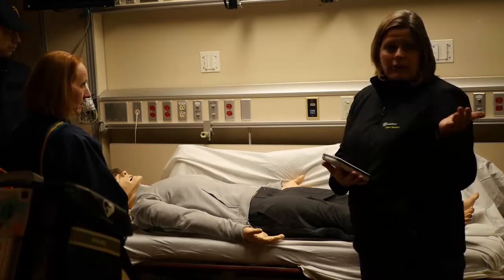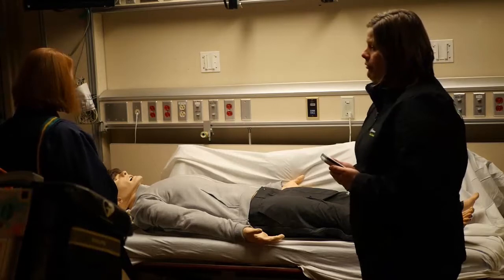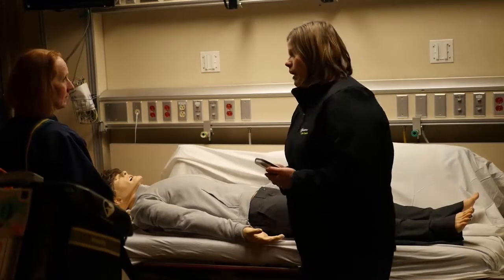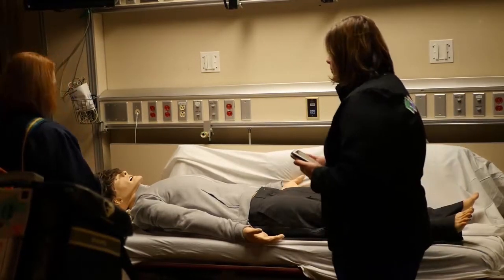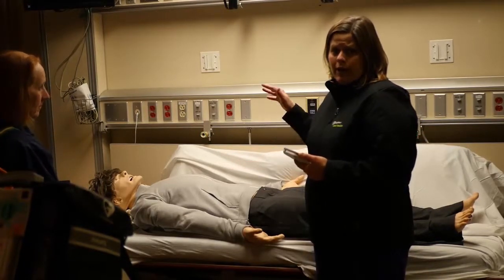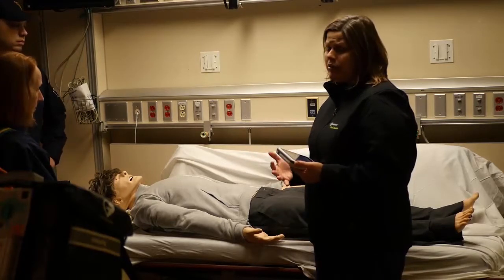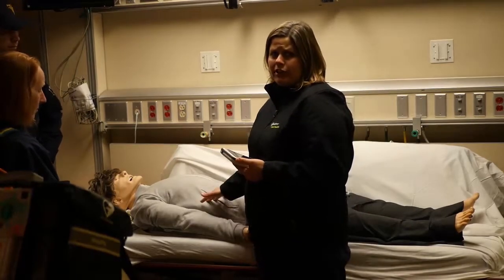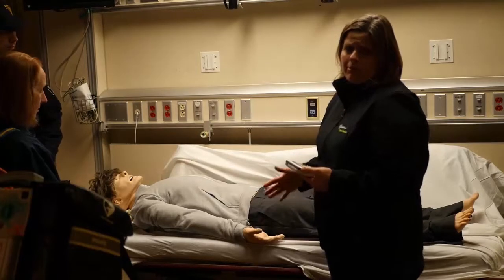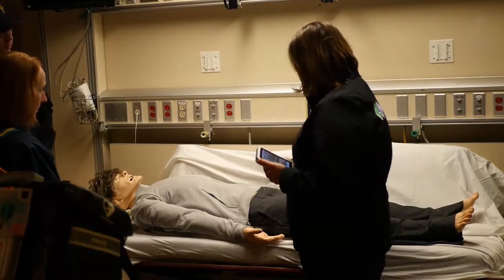And then my colleague Lori will be playing a different role in this scenario, and she'll introduce herself so that you know who she is and what role she's playing. Okay? And so at this point is where if they haven't had an opportunity to really use the mannequin before, that they can listen to heart and lung sounds. You can point out some of the different features and get into some of the more specifics so that they're actually able to use the equipment to the best of their ability.